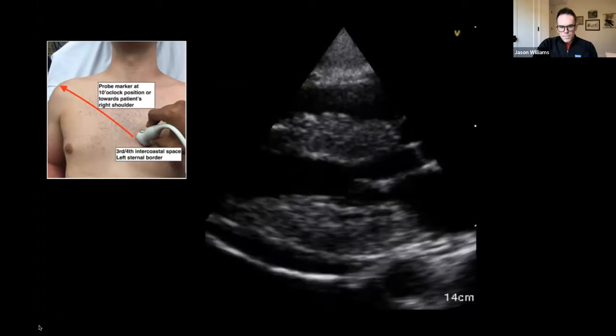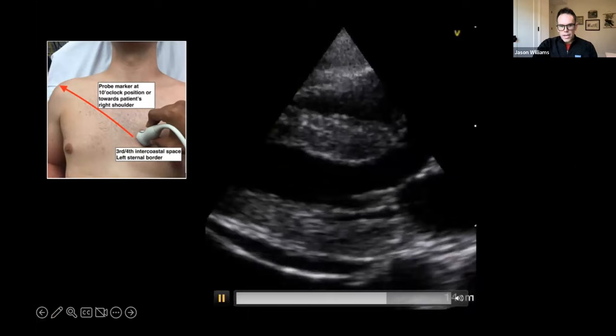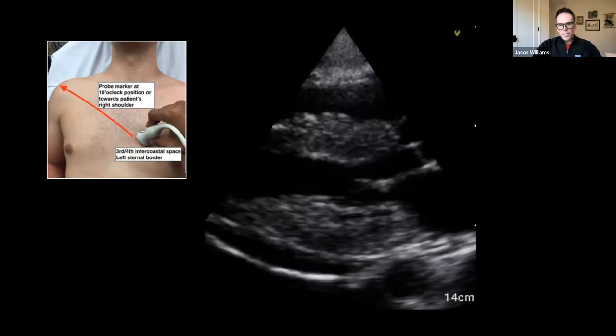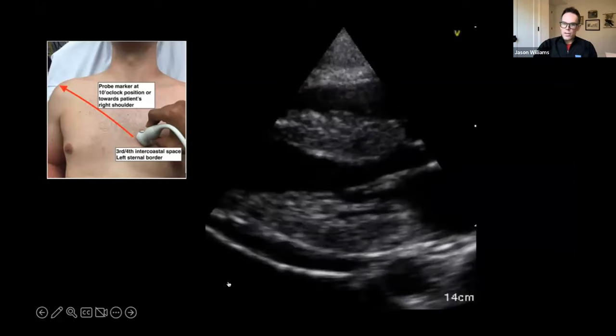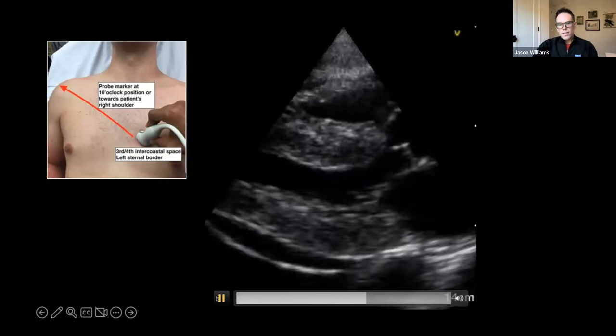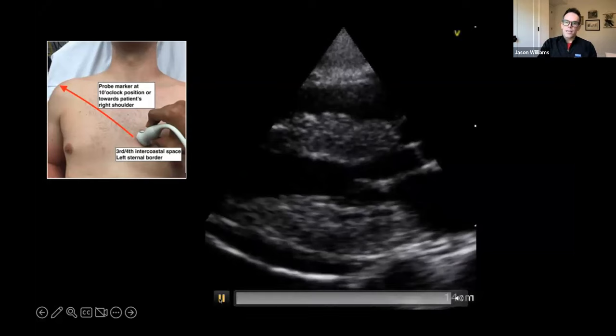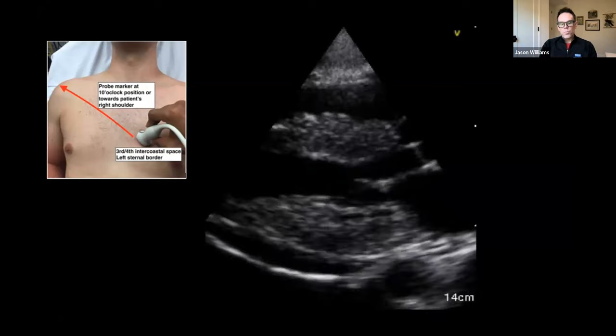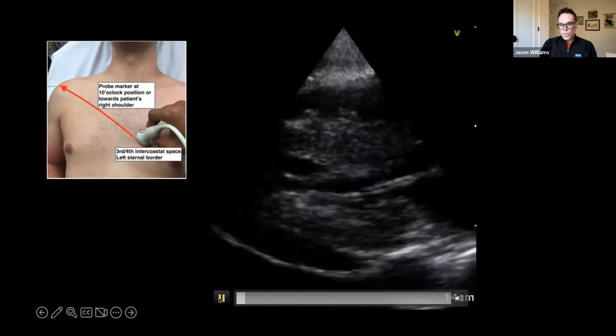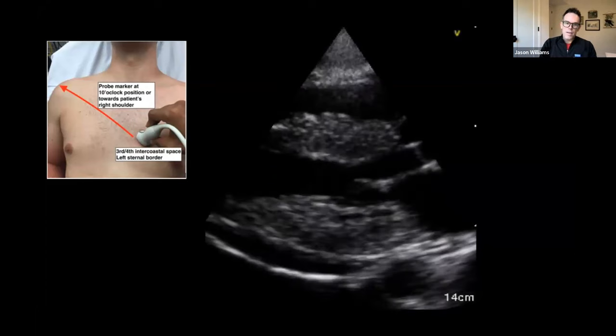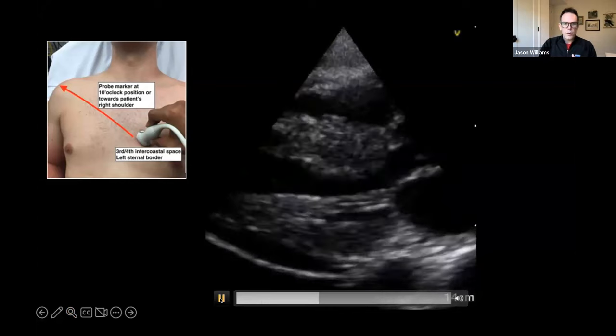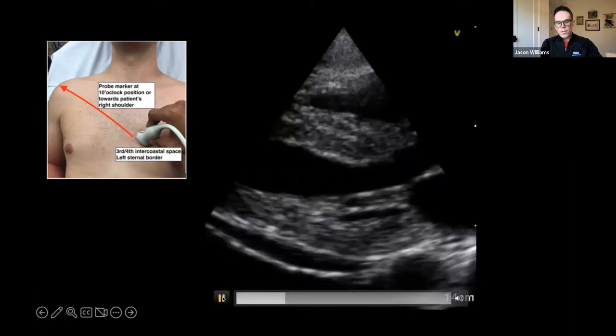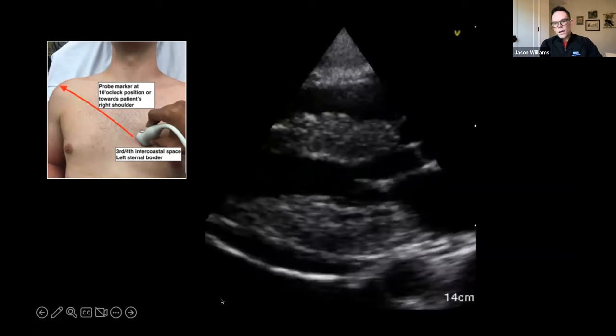Sure. So one of the things that we look at is that mitral valve movement, and you'd like to see it come up and get pretty close to the septum. And in this case, it does look like it's hitting the septum. And when that happens, that means you have very good cardiac output. You probably don't have reduced ejection fraction. The idea being that if the heart contracts during systole and ejects a lot of blood, then during diastole, you got to empty a ton of blood out of that left atrium to refill the left ventricle. And that's going to push that mitral valve way up to the septum versus someone that's got very low cardiac output. That door doesn't need to open very much because not much blood is flowing in. And so this is probably normal ejection fraction. And I confirm that by looking at the left side of the ventricle. And I want to see that septum and inferior wall pull together. And that diameter should shrink by about a third. And in this case, it does. So I think this patient's got good left ventricular ejection fraction as the echo previously confirmed.